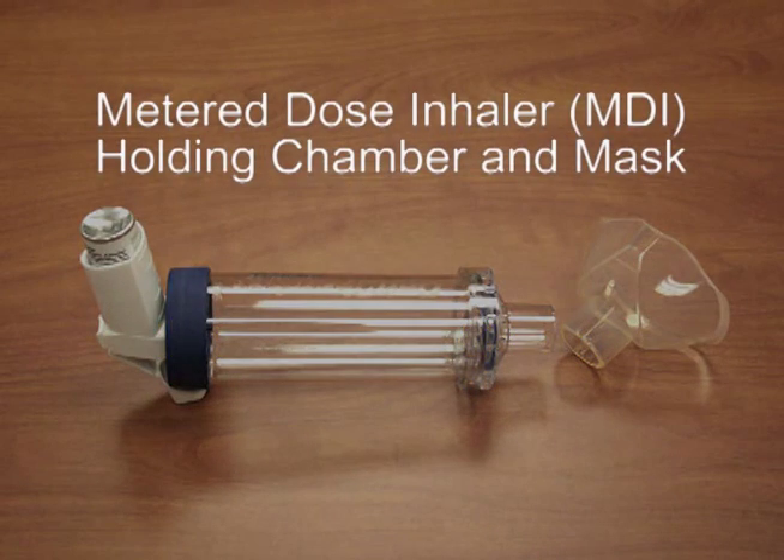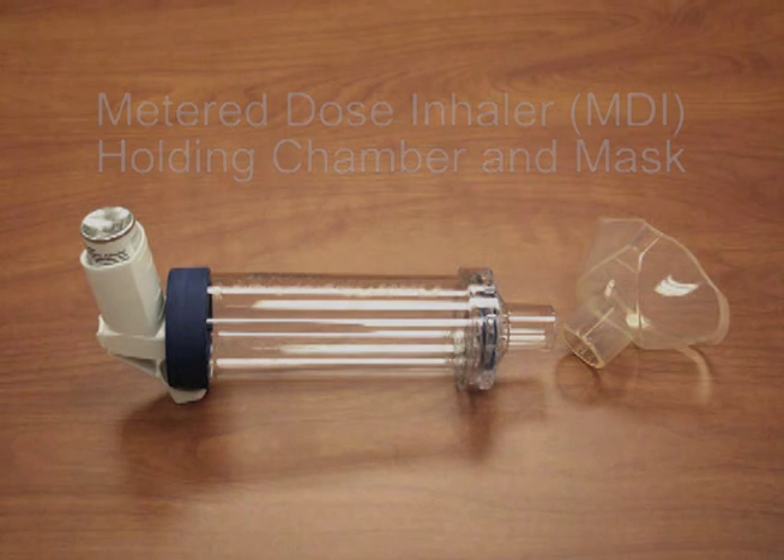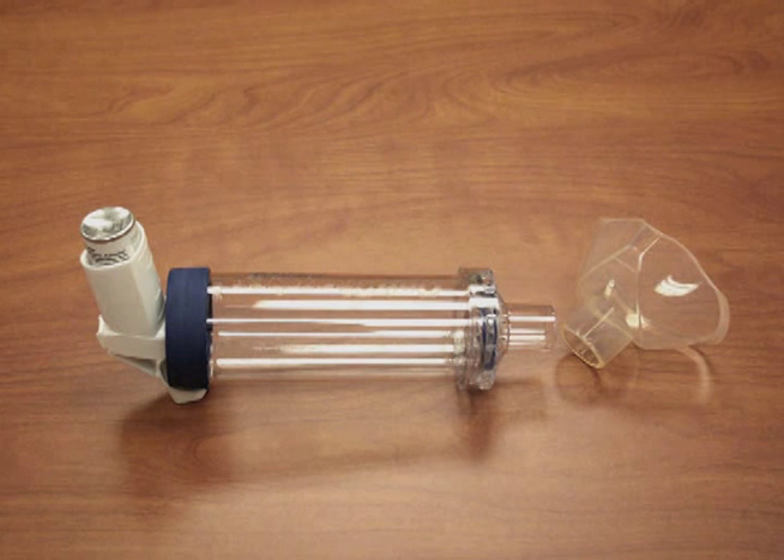How to use a metered dose inhaler with a holding chamber and a mask. A metered dose inhaler is also called an MDI. It is used with a holding chamber and a mask with infants and young children.